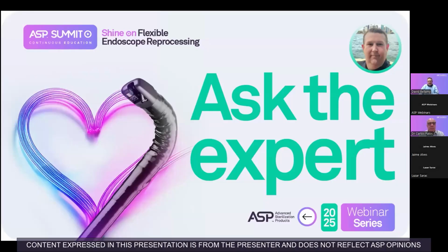I know definitely here, but there's no definite answer, and it would come down to standards. But I know with the standards and the guidelines we follow, our staff that are reprocessing have to do it regularly and have an annual base competency that's formally addressed. Yeah. I think it's the question that most people answered, that it was annually done.